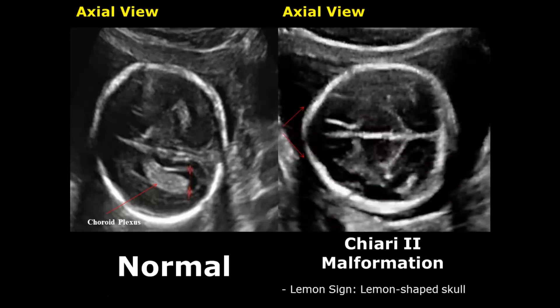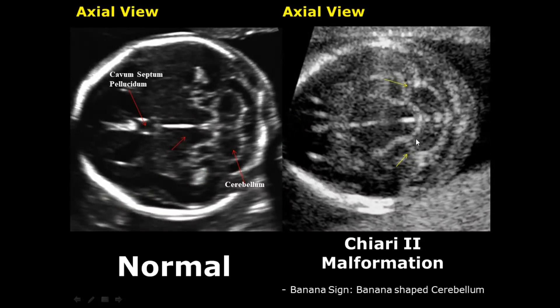Chiari II malformation is associated with characteristic changes in the shape of the skull and cerebellum. The skull resembles the shape of a lemon due to flattening of the frontal bones — this is called the lemon sign. Another sign is the banana sign, associated with the shape of the cerebellum: the cerebellum is shaped like a banana, bent and facing forward.